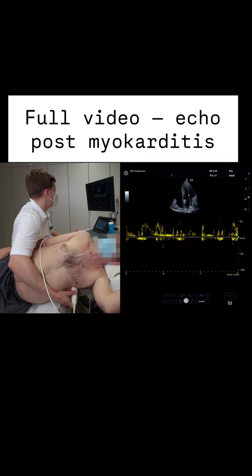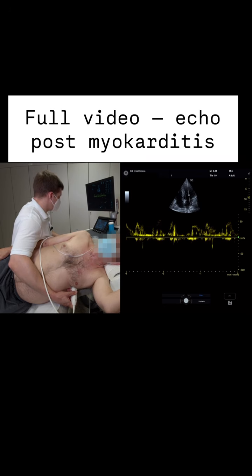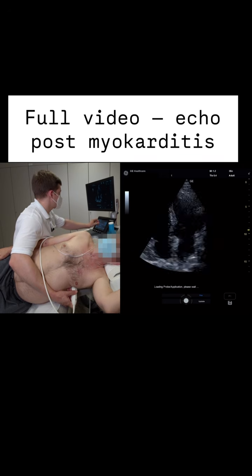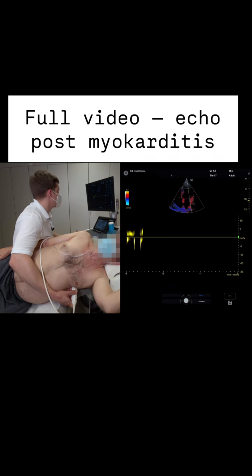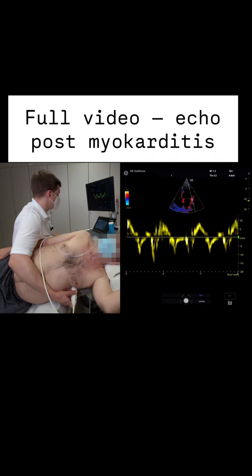We can also try and measure diastolic function. We have an E wave and an A wave. We are simply going to save it and calculate it later. Then we have to, of course, add tissue Doppler. Again, we need the pulsed wave Doppler, and we set the pulsed wave Doppler in a lateral and also a medial position of the mitral valve annulus.